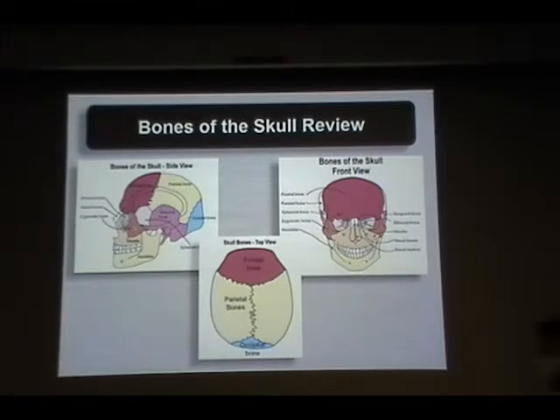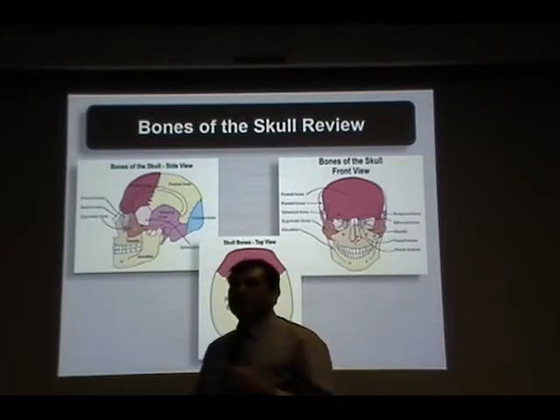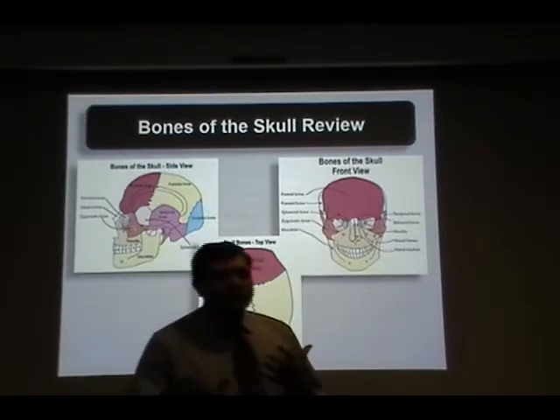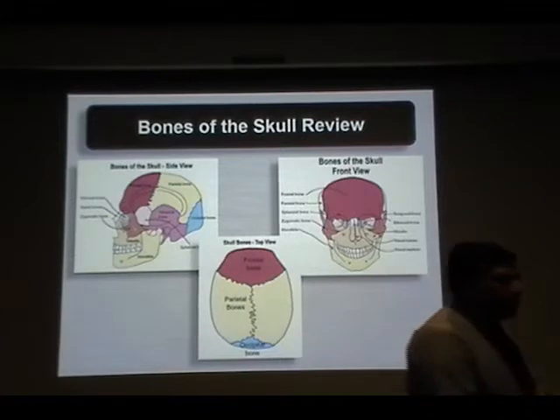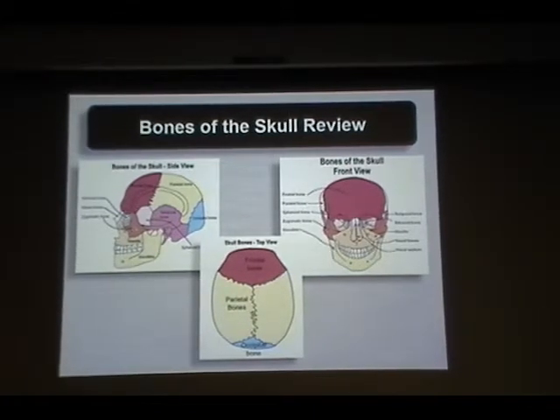And if you're going to place implants, at least you need to have a machine that captures 8 by 8, so from here to here. Because sometimes you may have to place implants in the maxillary region or in the mandibular region in the same patient. So at least you need to have 8 by 8 volume. And those who are from Canada, anybody from Canada?